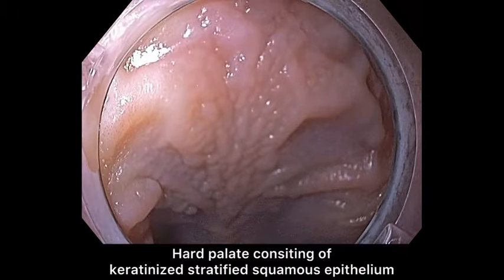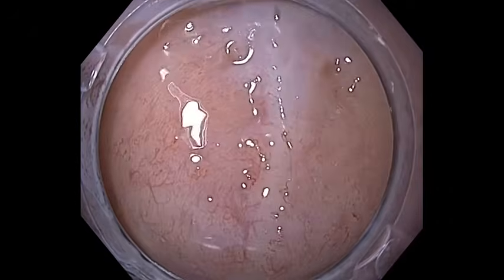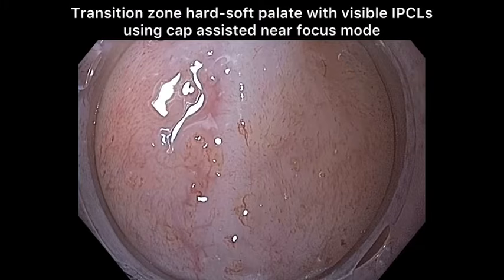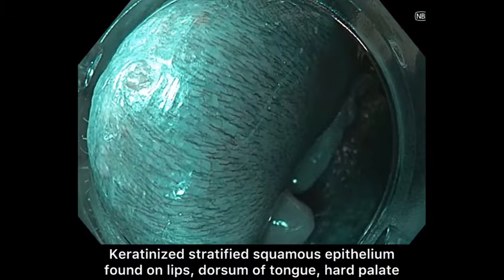Hard palate consisting of keratinized stratified squamous epithelium. Soft palate consisting of non-keratinized stratified squamous epithelium. Here we see the transition zone between hard and soft palate with visible IPCLs using cap-assisted near-focus mode. Same view using narrowband imaging. Keratinized stratified squamous epithelium found on lips, dorsum of tongue, and hard palate.